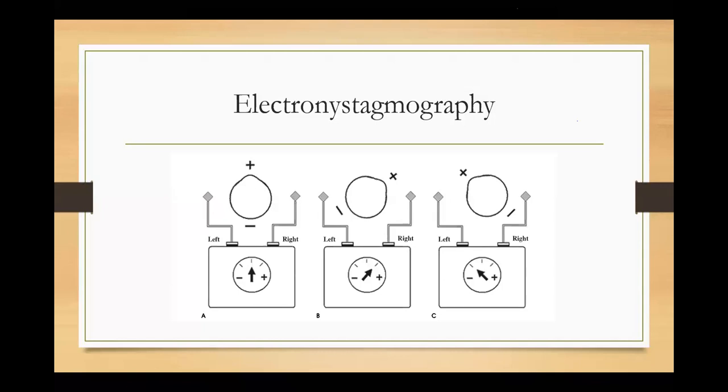In this example, your eye also has a positive and negative orientation like a dipole. The front of the eye is considered to have a positive charge and the back of the eye is considered to have negative charge. Now imagine we have kept an electrode on both sides of the eye, one towards the lateral side and one on the medial side close to your nose.